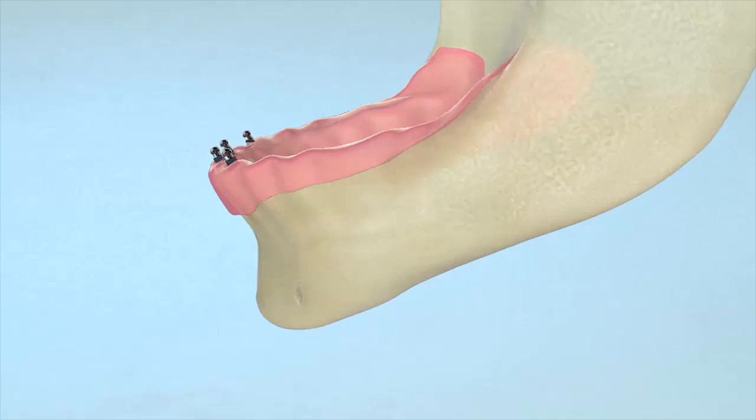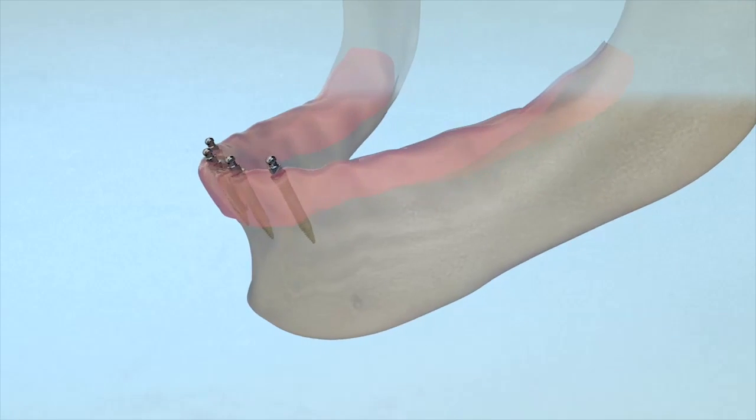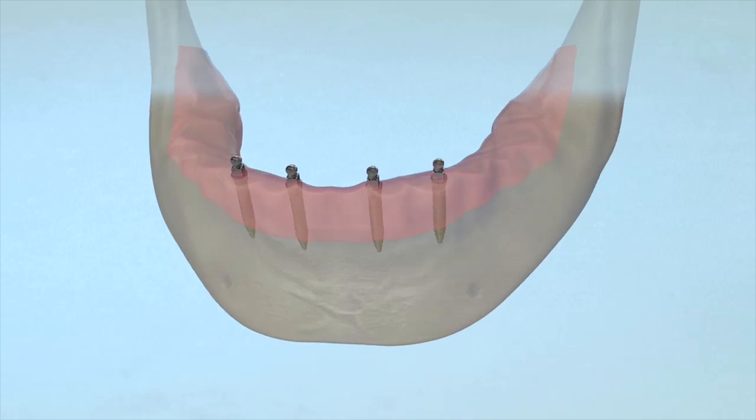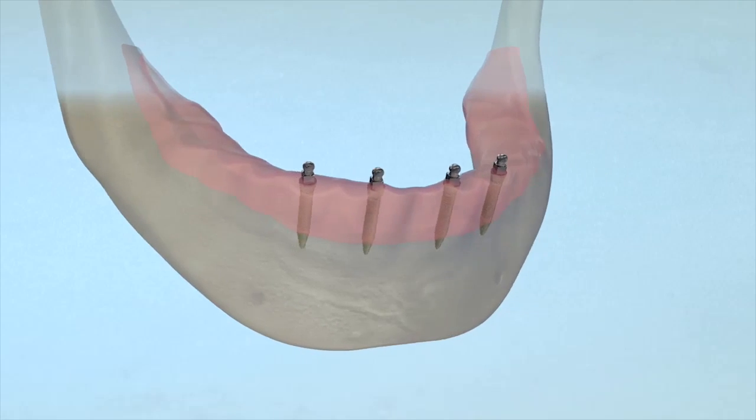In most cases, the patient can resume eating and chewing. Soft foods are advisable for the first few days. Gingival tissue should heal relatively quickly and the implants will become integrated into the bone over the next few weeks for long-term, secure denture stabilization.